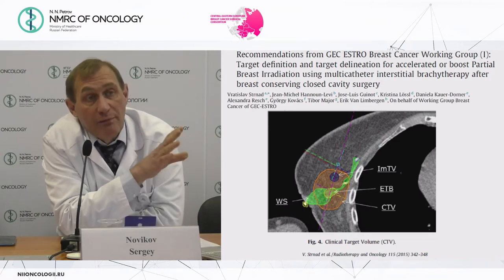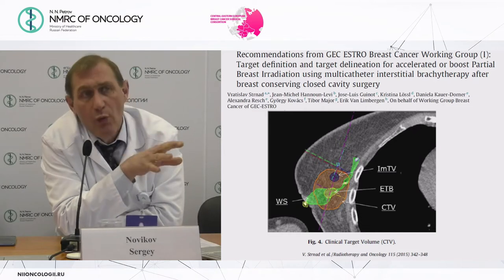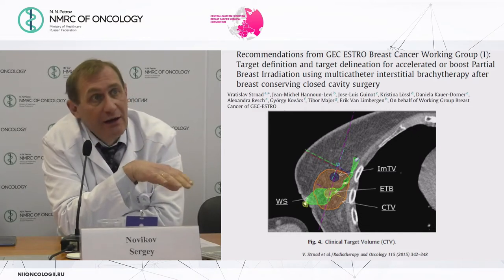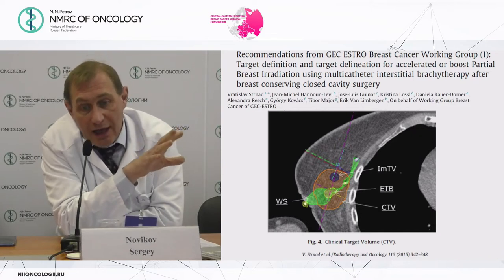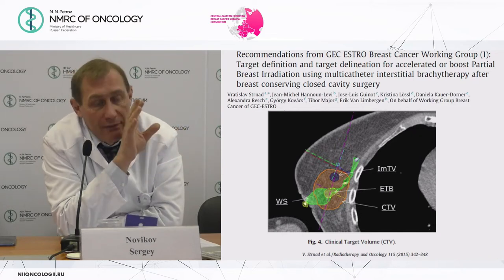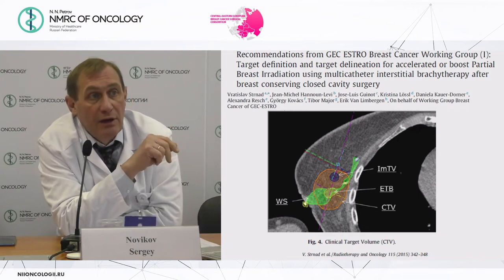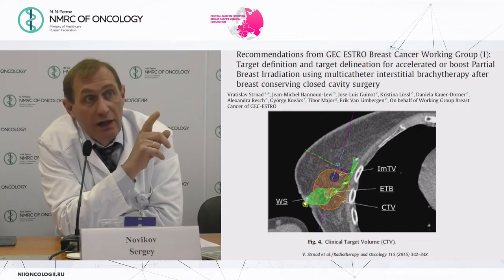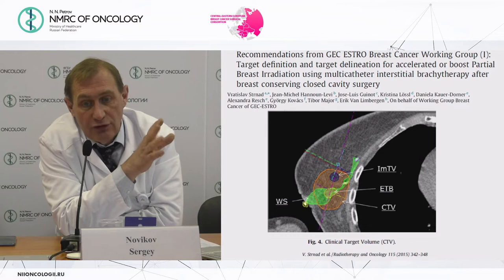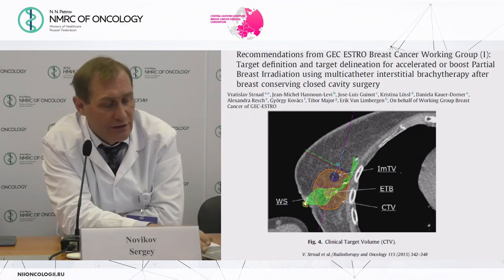This is how it must be done, and everything is very clear. We must know where the tumor was at the beginning. I again remind that we know some key points. We must see the scar, which is not always possible. I'd like to underline that we are talking about closed surgery, first of all. Even my first slide was not the result of closed surgery, but it is an exception in our institute.